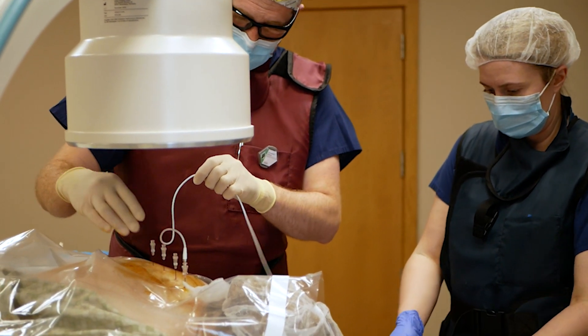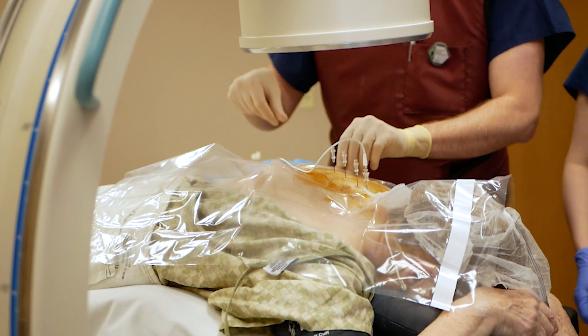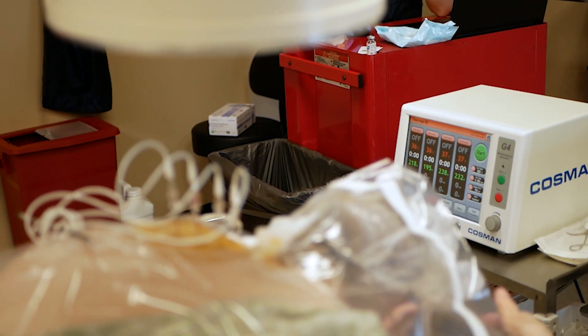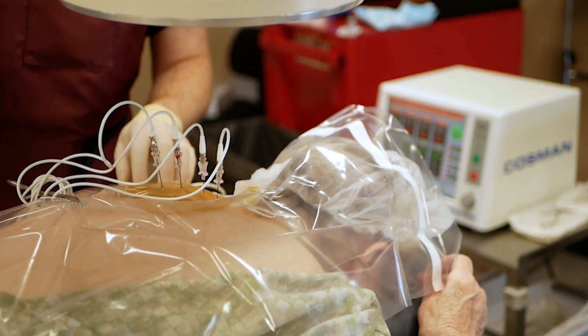Once the probes are in place, we do a series of testing to make sure we are targeting the correct nerve and staying away from nerves that we don't want to damage. After that testing process, we numb the nerve so that there's little to no discomfort during the actual ablation.